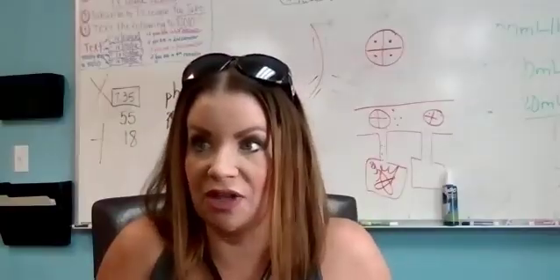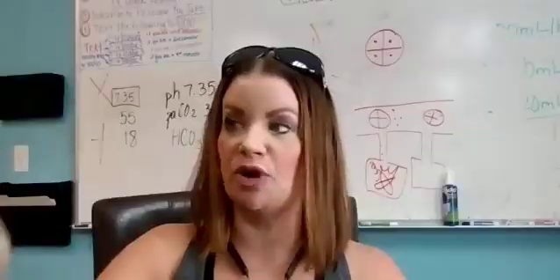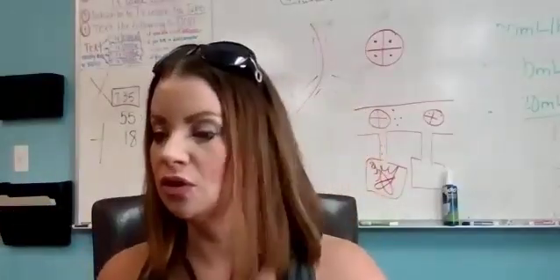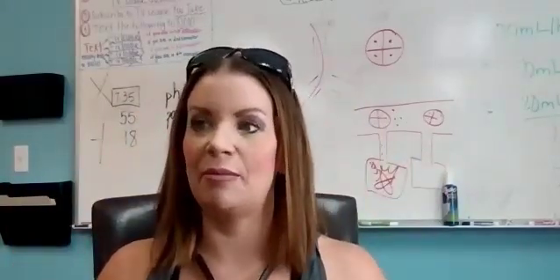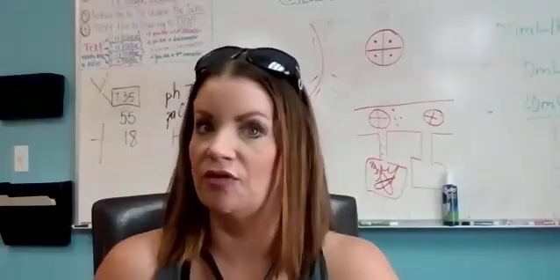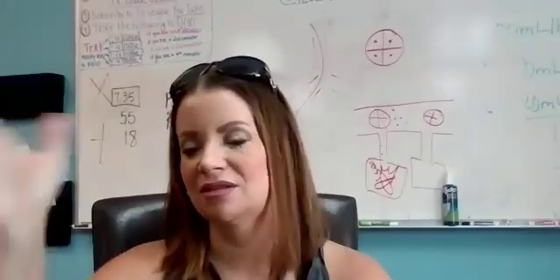If you're putting more pressure on the lungs, you're pushing pressure in, which means it's pushing more blood, more oxygen, which goes to the heart, right? But the heart is working harder, and it may not be getting the blood flow that it needs. So the preload may decrease, but the workload of the heart is still like, oh my God, I have to work a little bit harder, which it probably was anyway. That's just a test question thing.